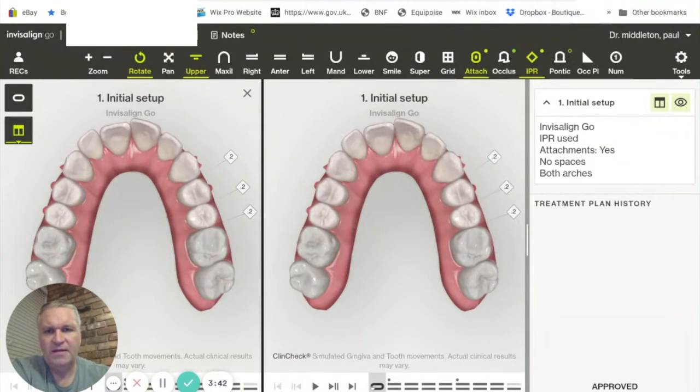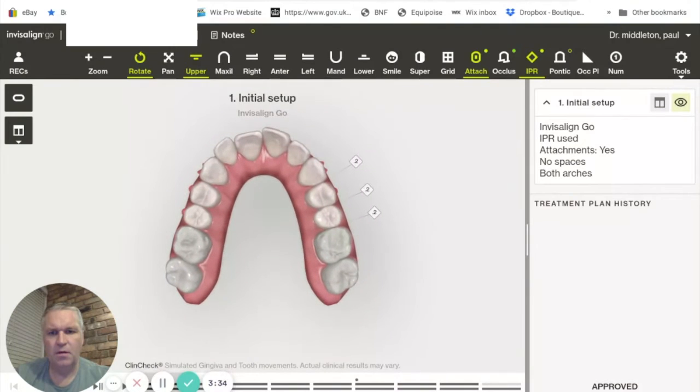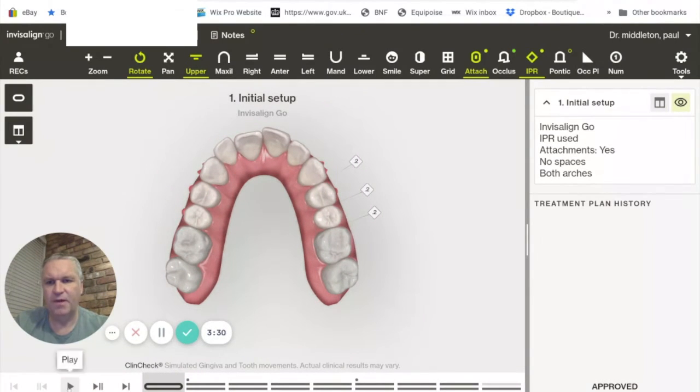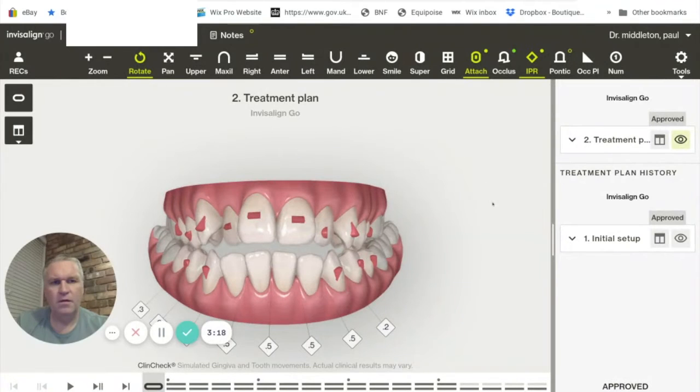We can take this back and it will actually show you how the treatment progresses. If I press play, it'll take us through an aligner at a time and show the teeth moving. Now, like I said, that's at the more mild end of the spectrum. So we'll look at another case here, which there's going to be a little bit more to do with this one.